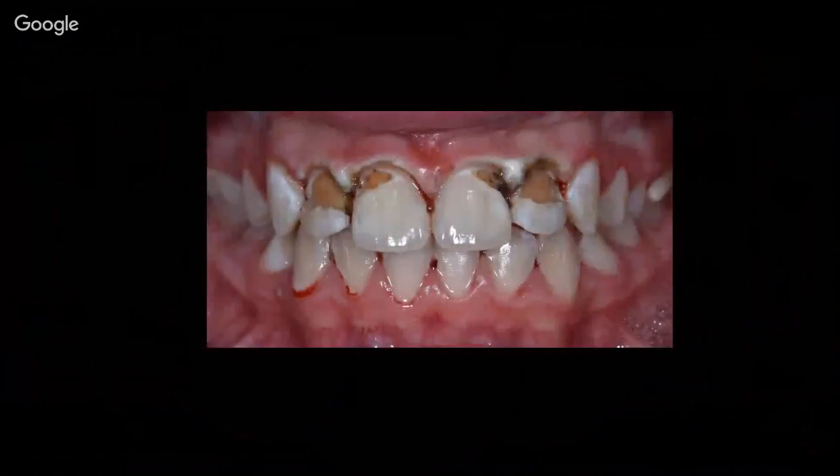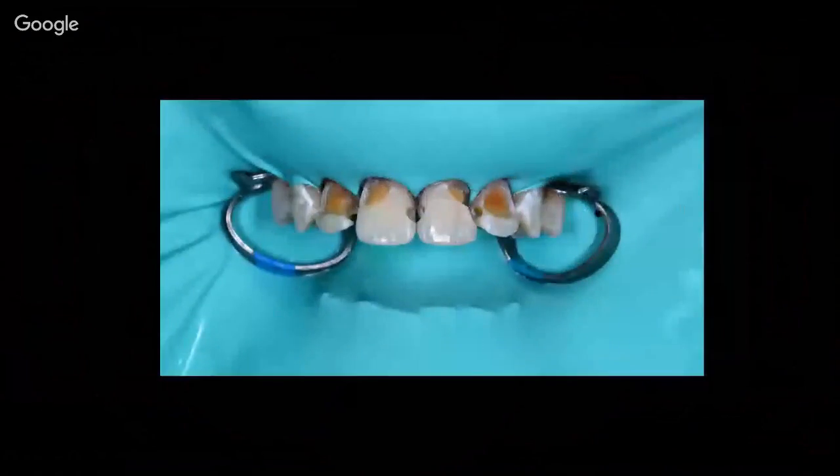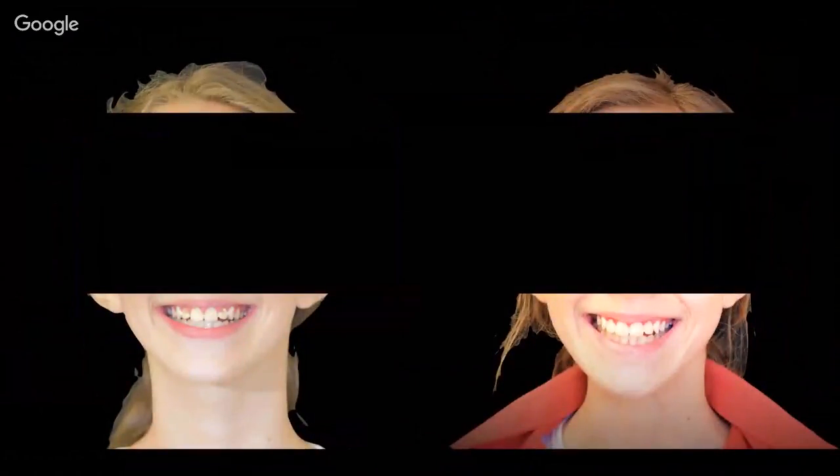Okay, so now we can see that the teeth look a little bit longer because first of all, I removed the plaque and the calculus, and then with the laser I did some gingivoplasty just to expose healthy enamel in order to restore those teeth. And we can see the teeth on the rubber dam and the smile after the treatment.